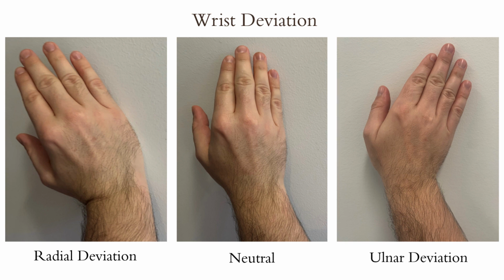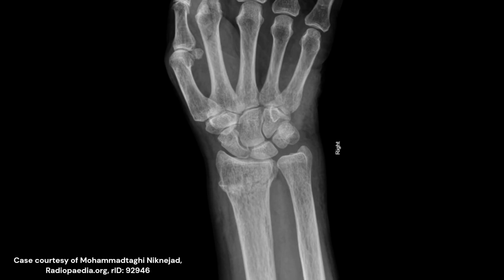We will now talk about wrist deviation. This can either be neutral, ulnar deviation, or radial deviation. This is determined by the carpal radial or carpal ulnar joints. Today we will only focus on the ulnar deviation, as it is far more common. Deviation is usually required when there is impaction or shortening of a fracture.